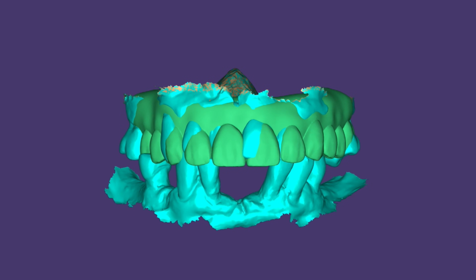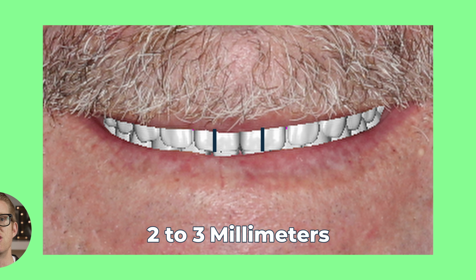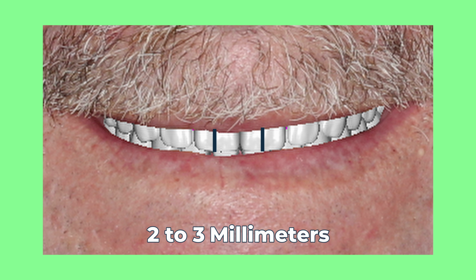And when the mouth and lips are at rest, we want to plan for the edge of the central incisors to be 2 to 3 millimeters below the edge of the upper resting lip. Generally speaking, this is the best place to start for cosmetics of teeth. The reason why we start here is because they are going to frame the rest of the cosmetic smile.